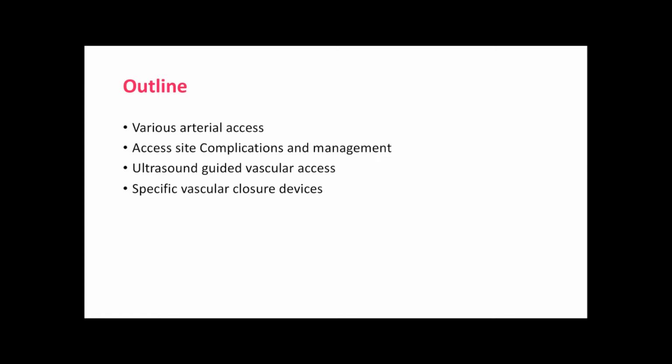Then we'll also discuss ultrasound guided vascular access. We are here in a field where percutaneous intervention is really expanding, and now a lot of new things are being done percutaneously which earlier used to be done only by open surgery, like I'm referring to TAVI and EVARs. For that, specific vascular closure devices have come, and they are also useful for early mobilization of patients.